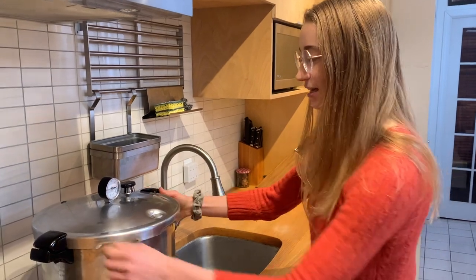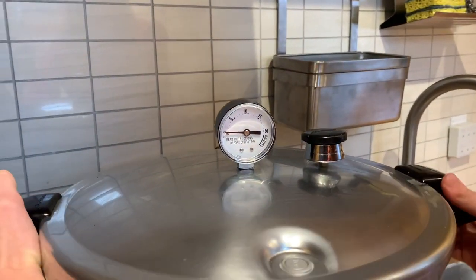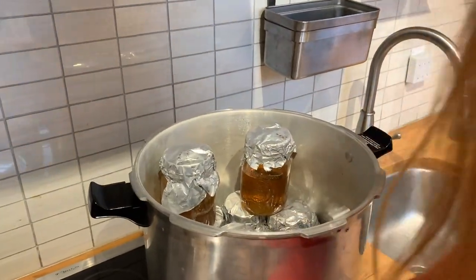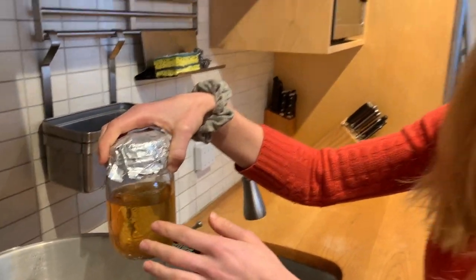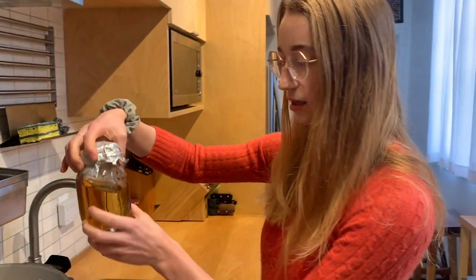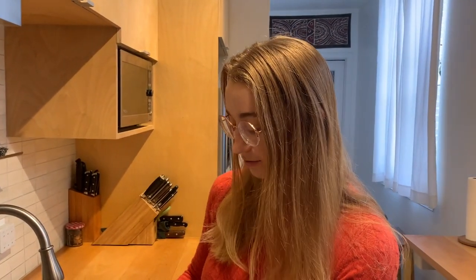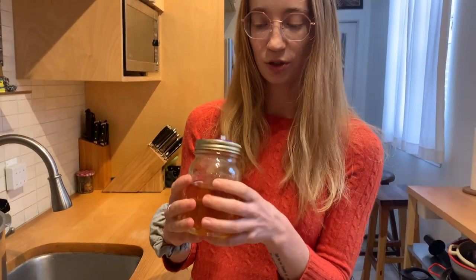We waited — today is the next day — and you can see it's down to zero and definitely cold enough to open. Look at the jars: you can see they've changed color. This is just the sugar caramelizing — it's okay and won't impact the growth of your mycelium. Once you have these, you can start doing your mushroom work with spore and liquid culture syringes, which we may show in other videos.